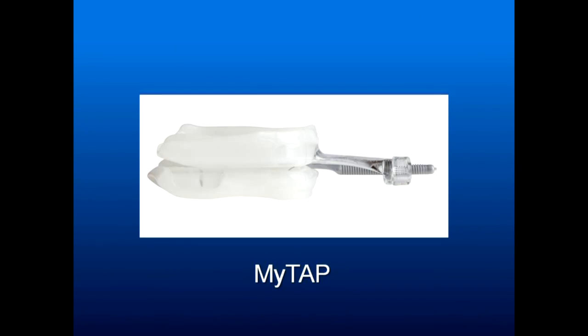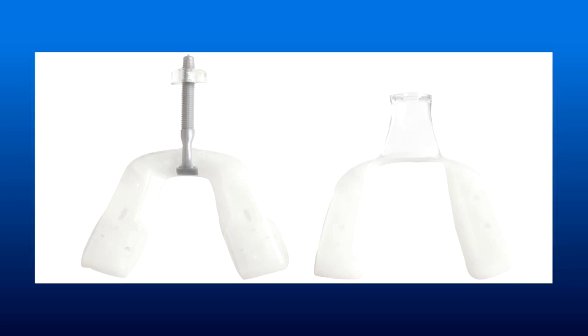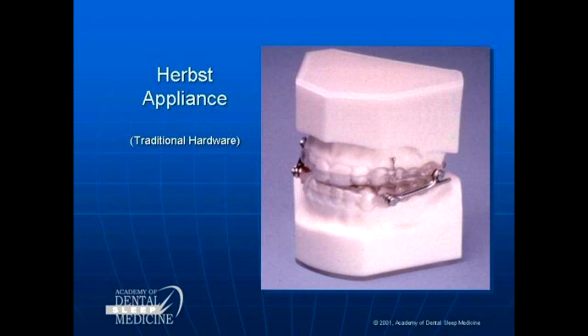But here's the design. You boil and bite the upper, boil and bite the lower, let them cool, put them together, put them in the mouth, and then that screw that's fixed to the upper pulls the lower member forward. And they supposedly last upwards of a year. Now whether they do, whether they're used, still too new to tell. And here's the design apart. Our basic appliance was the Herbst. And we all know that from ortho, move the mandible forward to encourage growth and development.